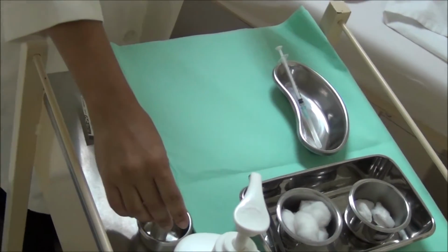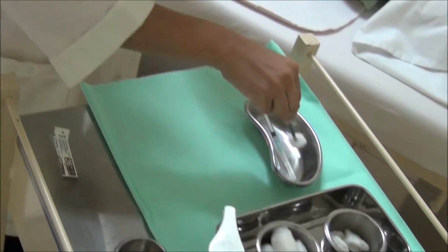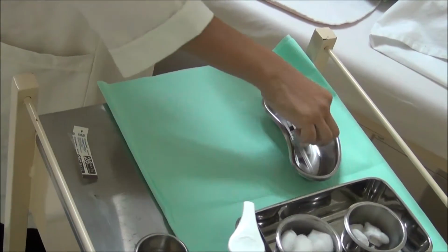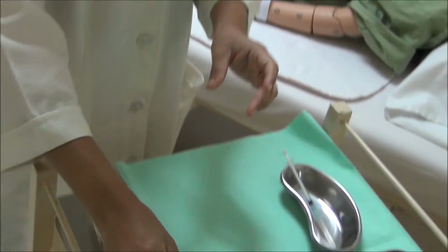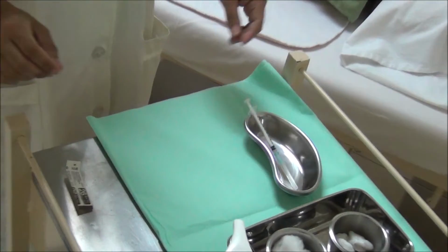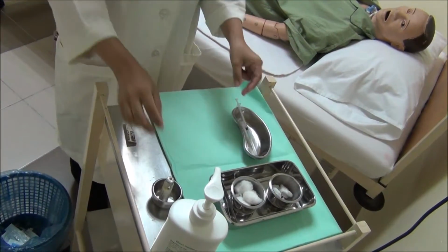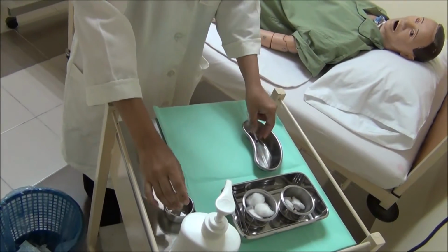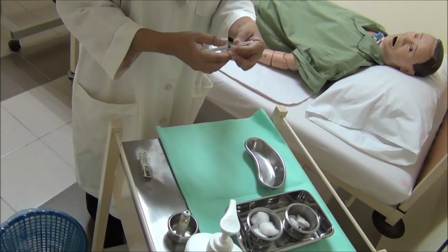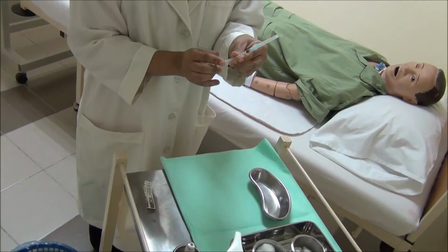Cleanse the rubber top with alcohol swab in a circular motion and allow it to dry. This is to maintain asepsis. Allowing alcohol to dry prevents the needle being coated with alcohol and mixing with the medication. She has attached the withdrawing needle to the syringe. And now she is going to withdraw the required amount.